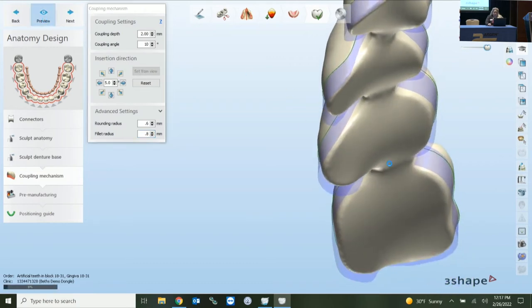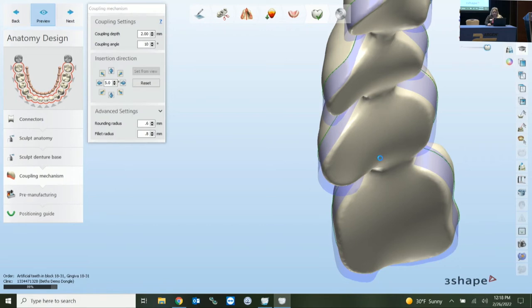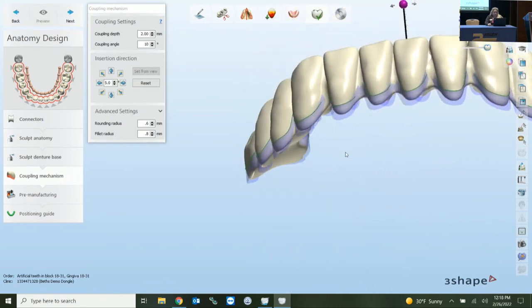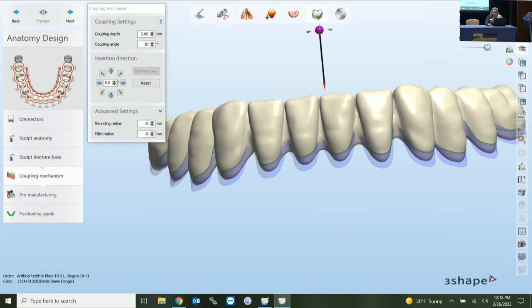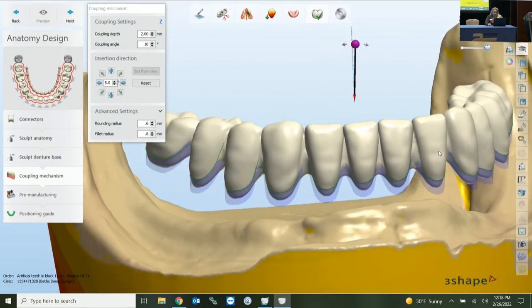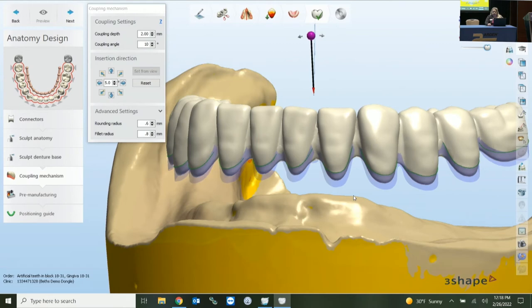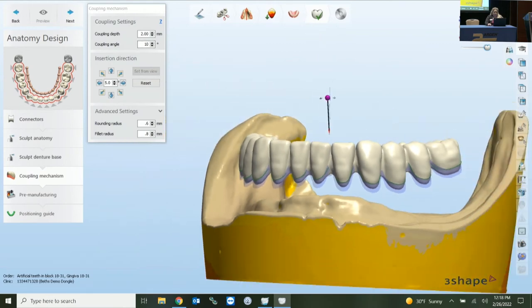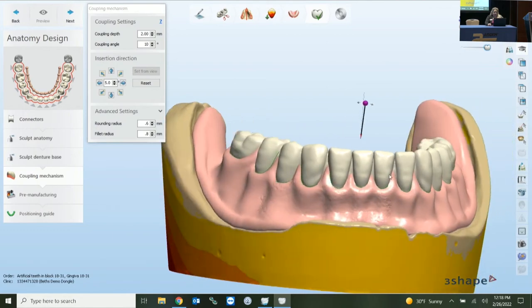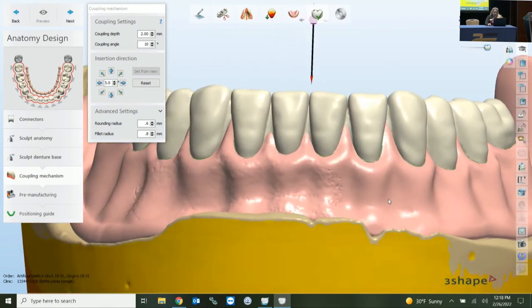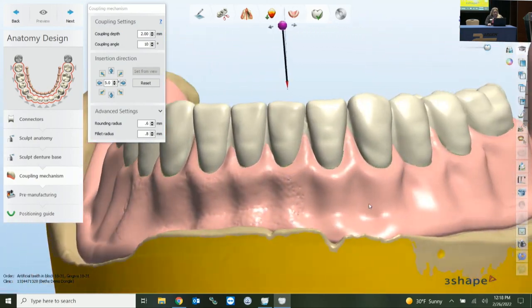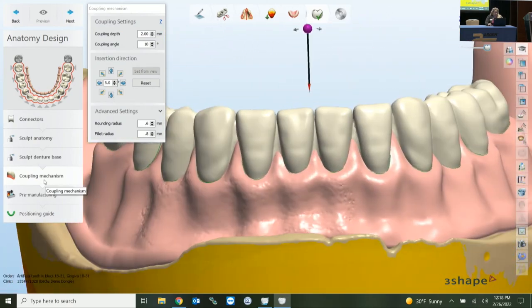Previewing again with default settings — nice and rounded, two millimeters in. Your intaglio surface clearance determines whether you need to lessen that setting, but we have plenty of space for the two millimeter coupling. We can't visually see the pockets at this point, and you can still sculpt your denture base a little more if needed. Let's keep going to pre-manufacturing.